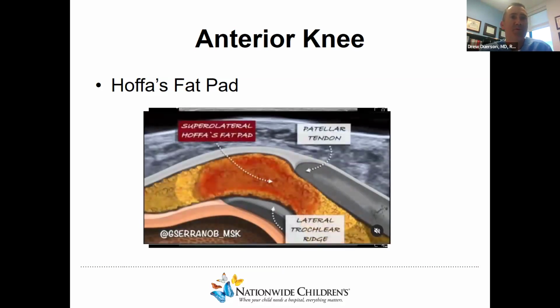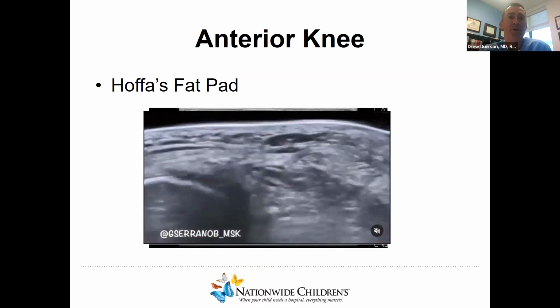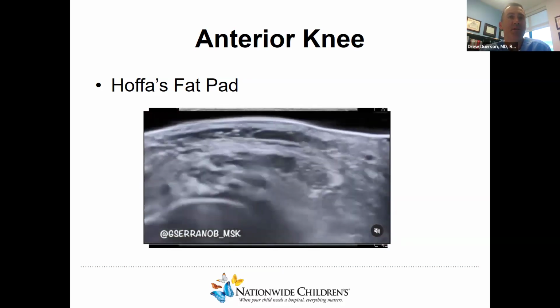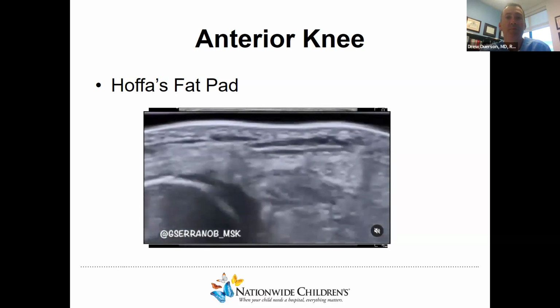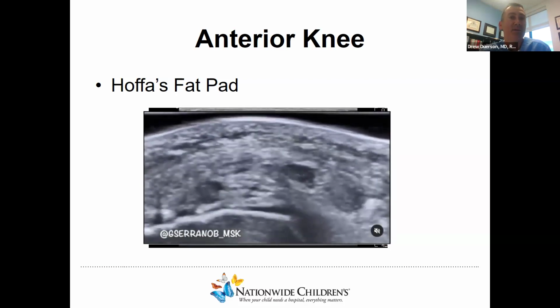And here you can see a good example of Hoffa's impingement, which I think is frequently associated with lateral patellar subluxation and patella alta, which is important in this case. For me, I always relied heavily on MRI to show that classic edema in the fat pad and some lateralization of the patella and patellar tendon. But we can evaluate this very nicely with ultrasound, and we can see a mixture of findings. It's not just edema, but we can see sliding of that superolateral fat pad over the lateral trochlea. And then we could see some impingement of that between the trochlea and the lateral fibers of the patellar tendon. And then maybe even a snap, which I think this video demonstrated very well.